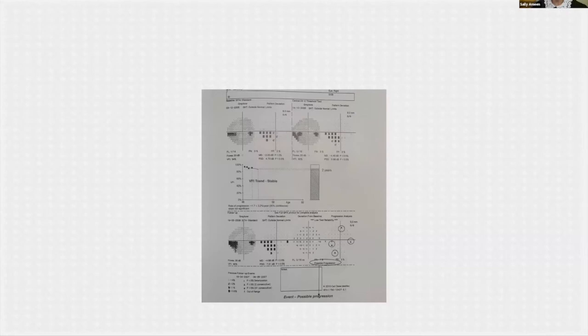And again, just to give you an indication, when any trials are done looking at visual field progression, there's always a learning curve for the patients. The first 3 visual fields that are done by the patients are normally not included in any further analysis of the disease, because there is a learning curve to doing these tests. And it does take them at least 3 to 4 goes to get as accurate with it as possible.